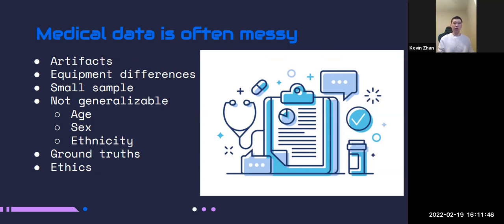So if you were a machine learning engineer, you would have to hire some experts like ophthalmologists to label the data for you, which can get quite expensive. Another option is crowdsourcing. So you can get a lot of physicians to basically decide on what would be the best label or best segmentation of the image. And both methods are quite common.